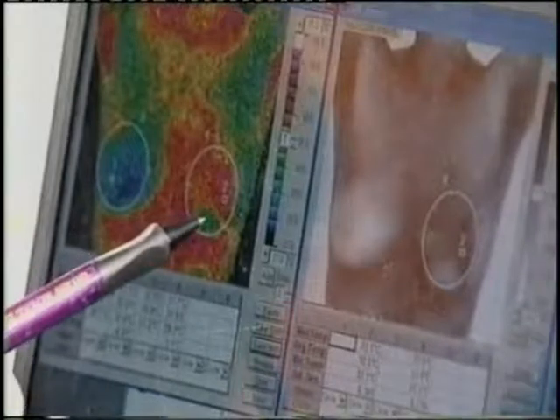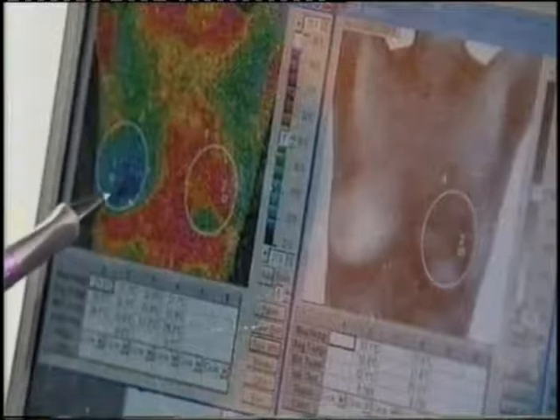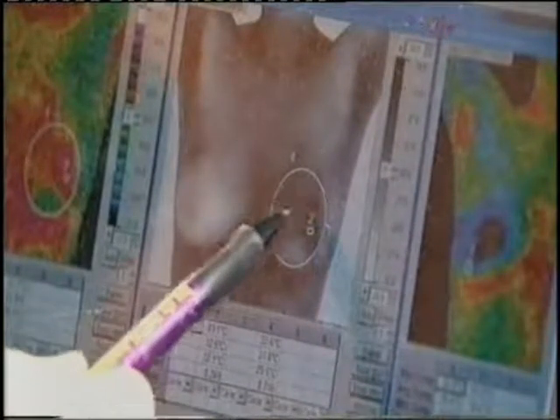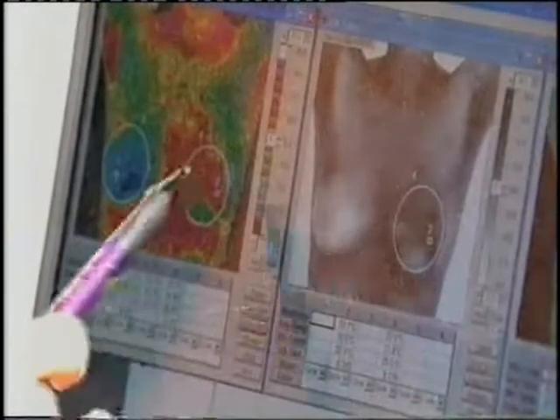You've got your positive. Let's have a look. This is an example of a lady who has breast cancer, and I think you can see instantly. Remember, I said we compare one breast to the other. We compare heat changes one side to the other. This is the side that has the breast cancer. You can see there's lots of heat, lots of red, compared to the right side, which is clear. And if you look on the grey scale here, it doesn't show very well, unfortunately, on this particular view, but there are some abnormal blood vessel patterns here. So we have a difference in heat, which actually does not cool after the cold challenge. So this is very clear.